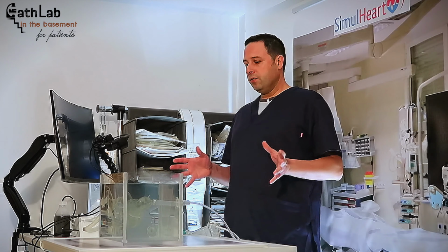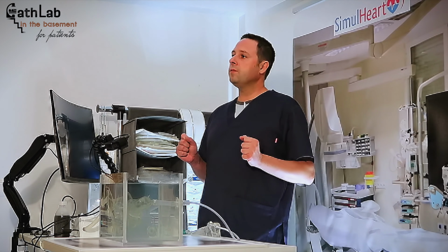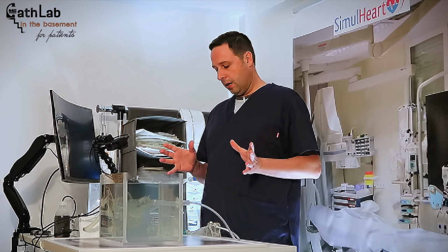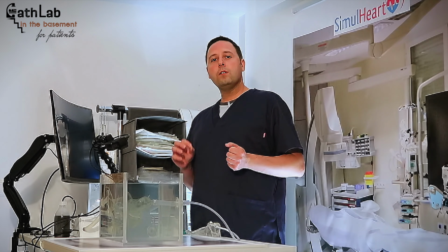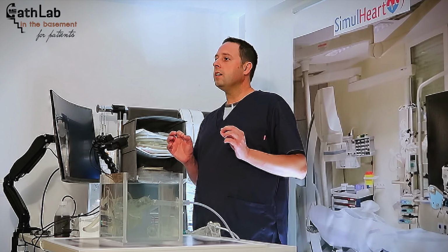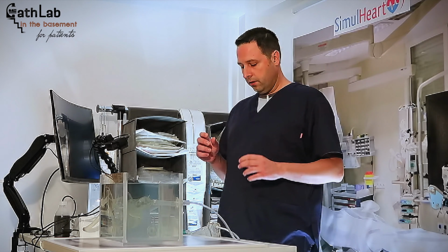So this is a clean procedure. First of all, we have to clean your skin in the places where the cannula will be inserted in your arteries. That is the first step. Then a local anesthetic is applied and a sheath is introduced in your artery.